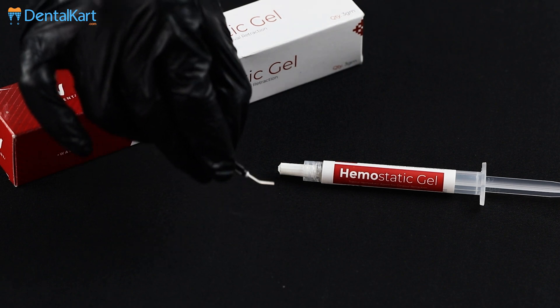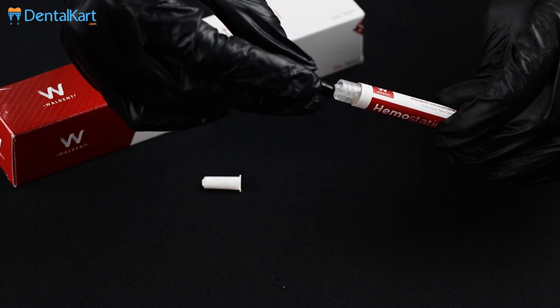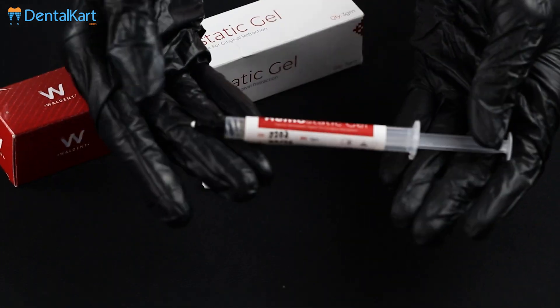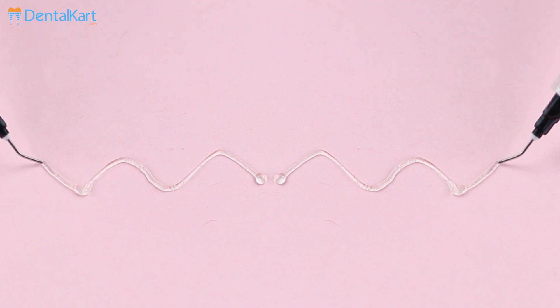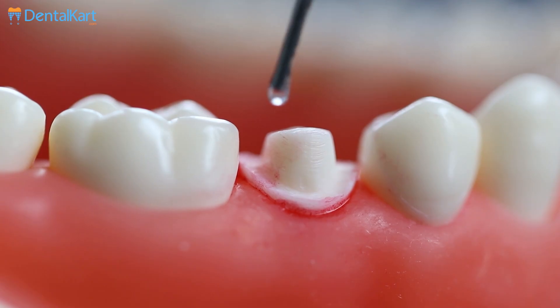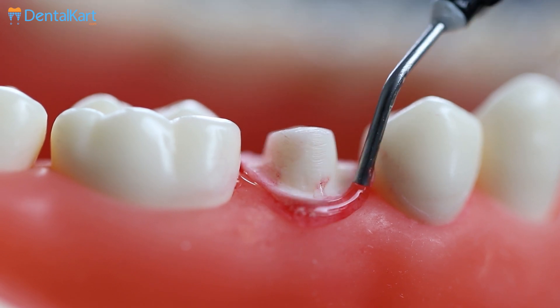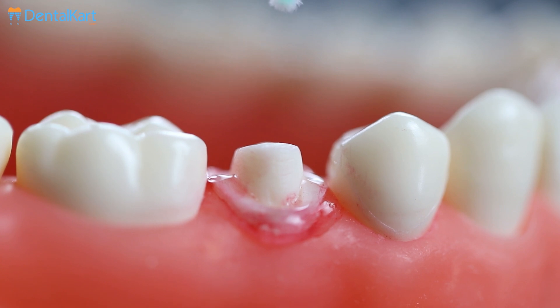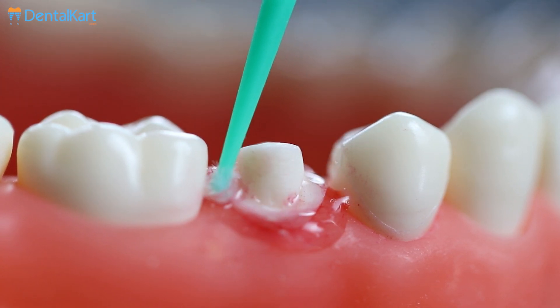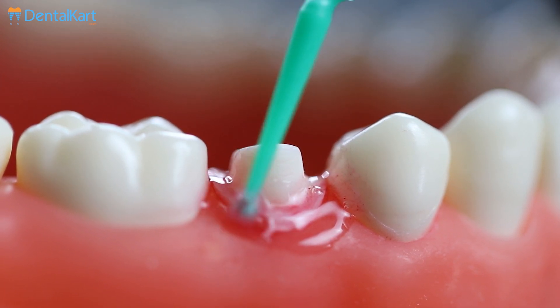Attach the applicating tip to the hemostatic gel tube and check for a smooth flow of material. Now apply hemostatic gel directly to the bleeding area. Take a cotton-tipped applicator, rub and apply pressure to the bleeding area. Keep rubbing and applying pressure for two minutes.